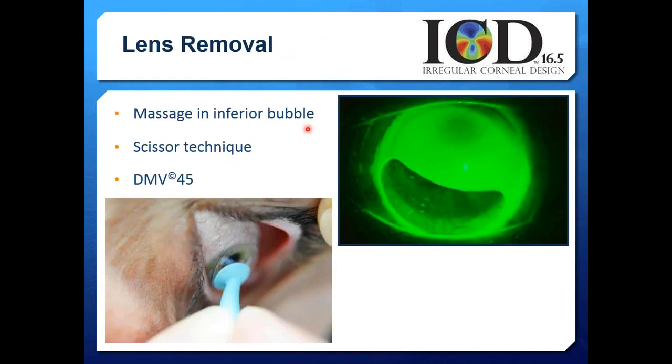Now, with a sealed scleral lens, often you'll find that as it seals itself 360 degrees around and creates a negative suction force with the fluid, if your patient is having trouble popping that lens off, what you might find easy to do, or makes it easier for the patient to remove it, is create a removal bubble.